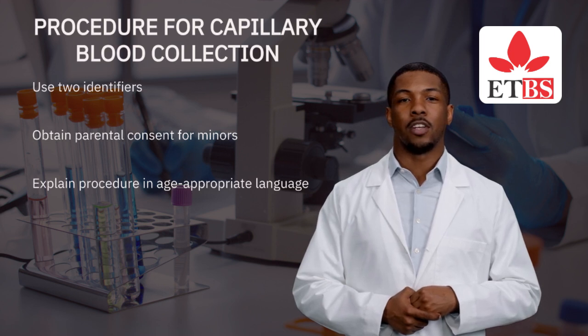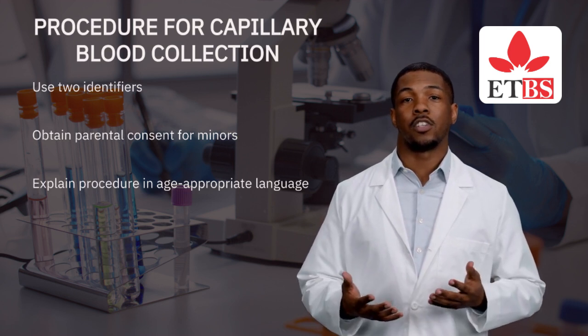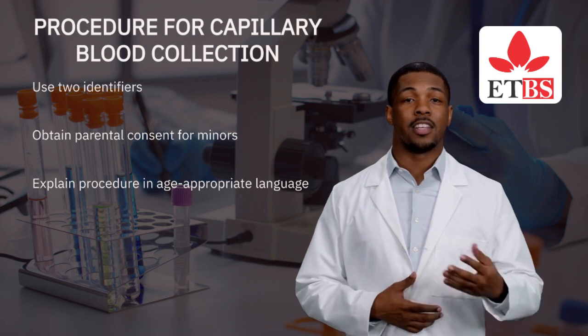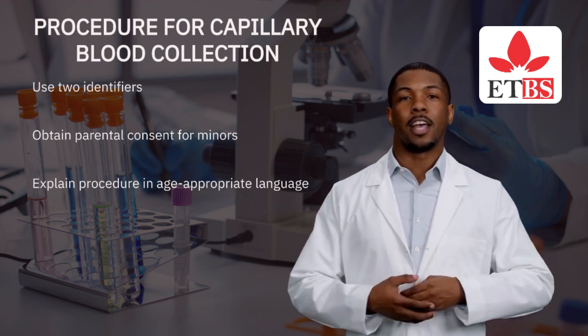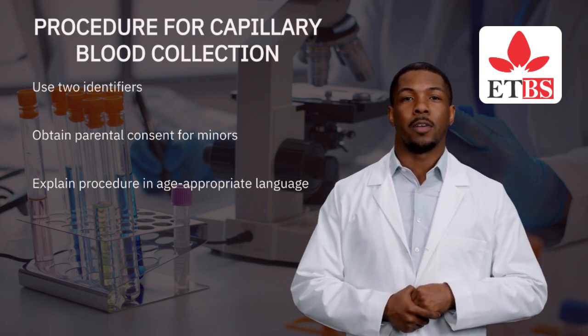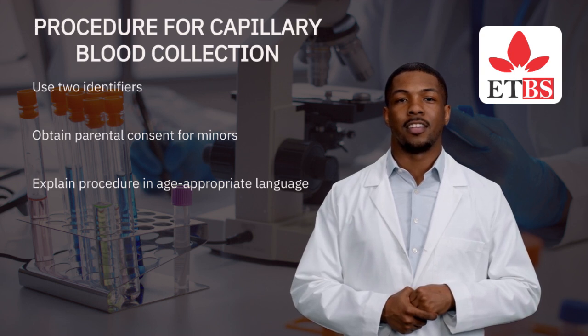7.5 Procedure for capillary blood collection. Patient identification. Use 2 identifiers. Obtain parental consent for minors. Explain procedure in age-appropriate language. Site preparation: warm site to increase blood flow. Clean with alcohol and air dry. Do not touch cleaned site again.